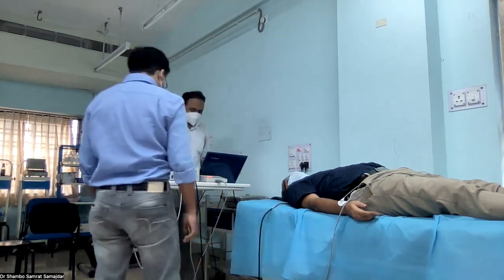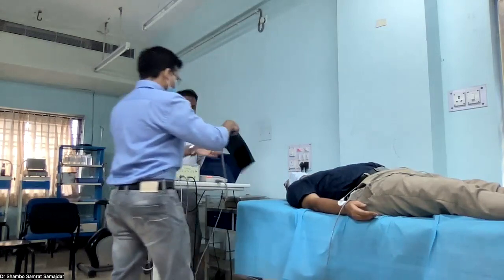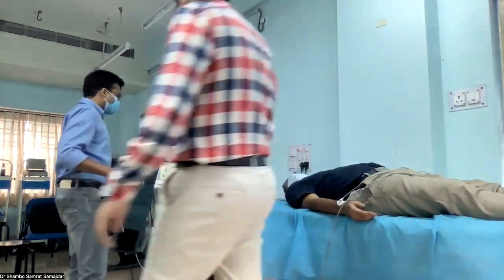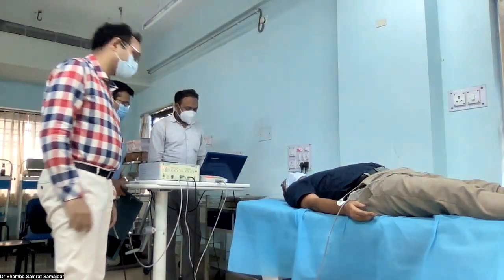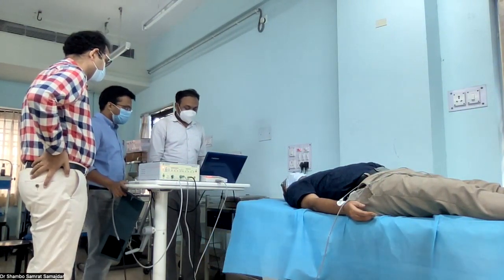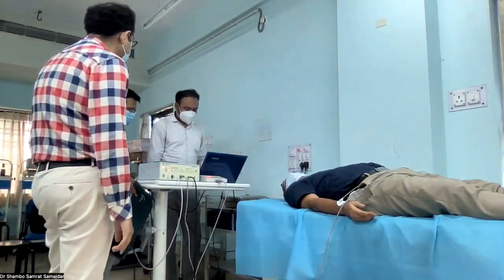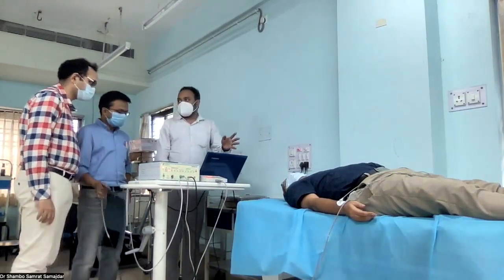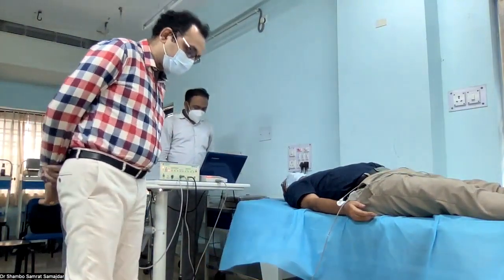So all the leads are placed. Just trying to log in to the software. So there is one software, and we need to first of all log in to that software because this is the mechanism. So we have got the continuous ECG with us, and now we'll ask the patient to be in supine position and take the normal resting ECG. So we are going to take the normal resting ECG first.